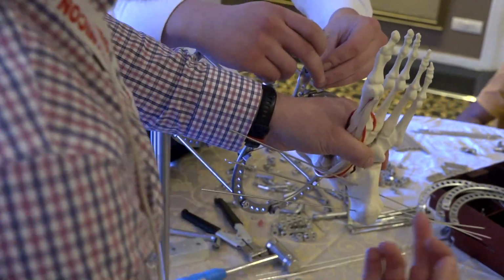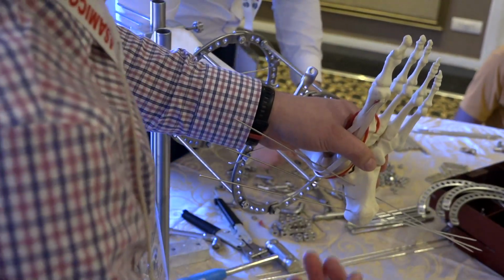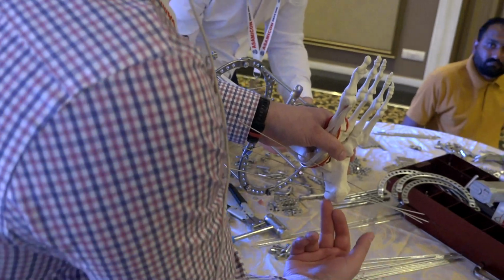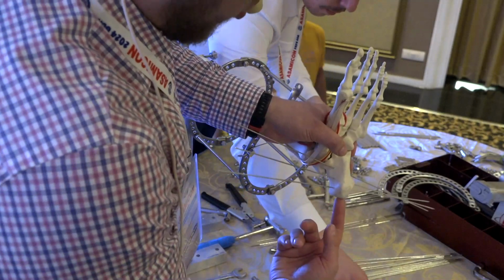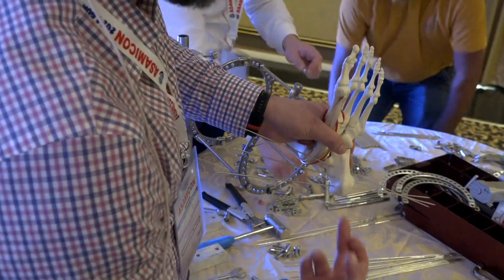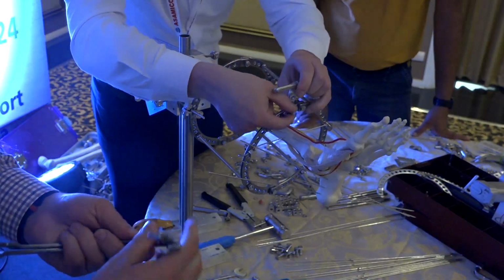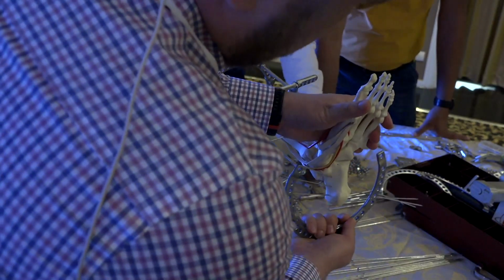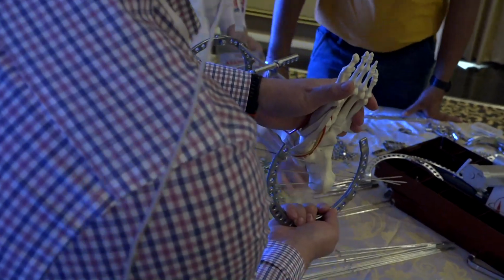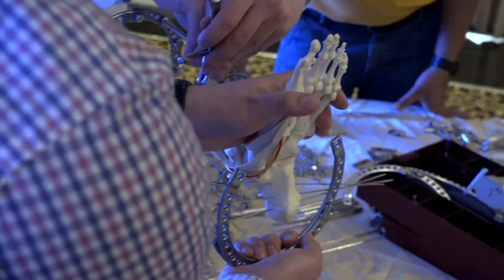Sometimes when we have osteoporosis of the calcaneum, we can put from the Achilles tendon side of the calcaneum one more K-wire or half pins as you like. It's possible. So usually for fixation of the hind foot we use three-quarter or half rings, something like that.